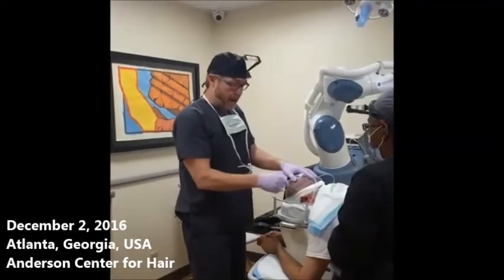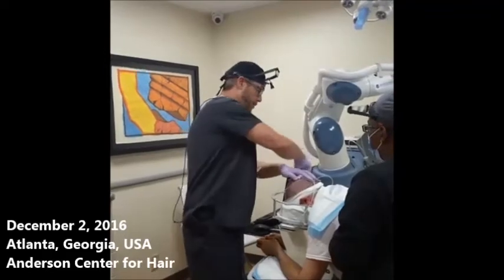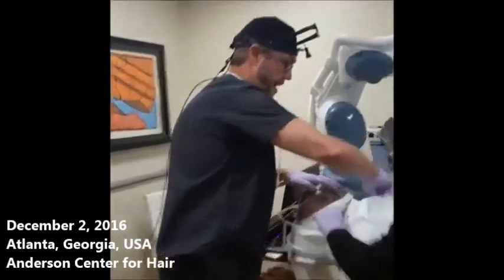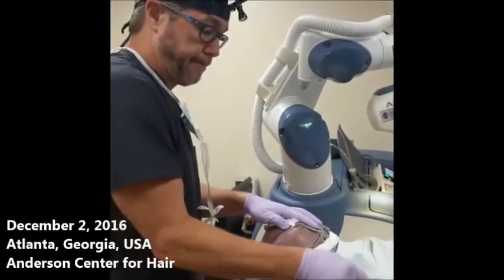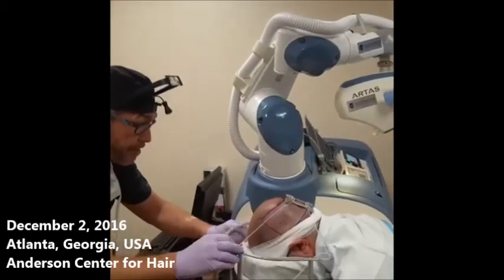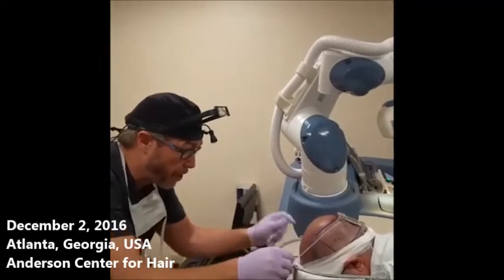Place a little upward traction on the tensioner, because that's kind of the direction the robot will push. Then we fasten it in. I'm going to make a good judgment to make sure it's nice and flat. The robot really likes it when it's flat, so it's important to do that.